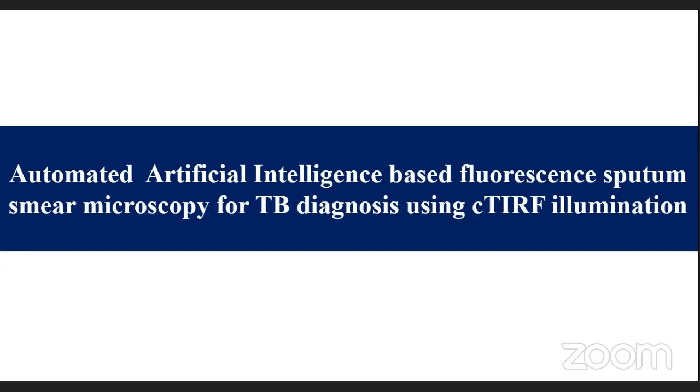So we thought, if we can remove the aspect where the healthcare worker is involved in observing the sample, then the sensitivity can be enhanced further, and the variation generated by human intervention can be reduced to a minimum.